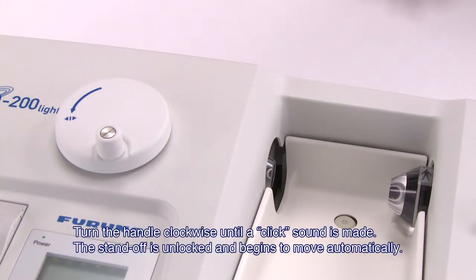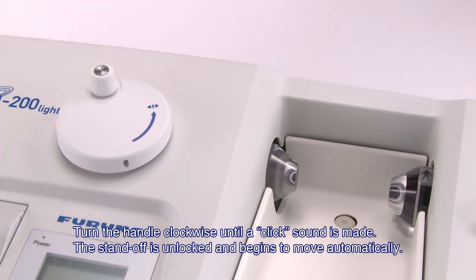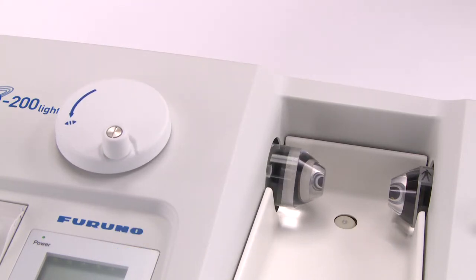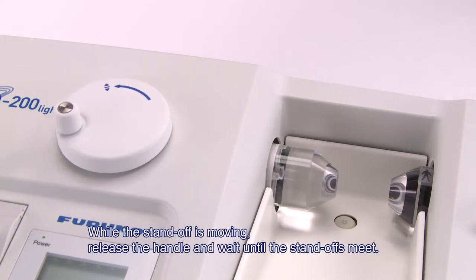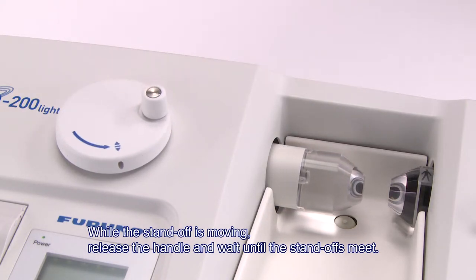Firstly, turn the handle clockwise until a click sound is made and the standoff is unlocked and begins to move automatically. While the standoff is moving, release the handle and wait until the standoffs meet.